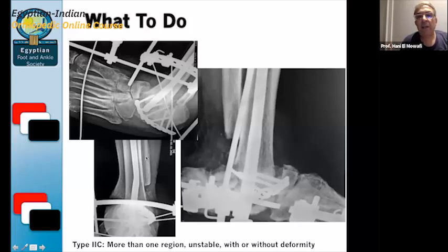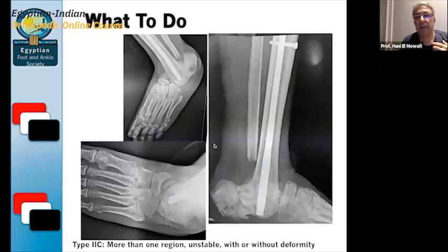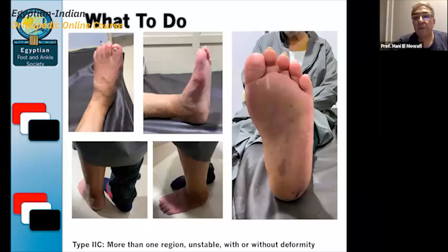After that, we removed the plate, but we removed the apparatus first. While removing the apparatus, there was a dehiscence of the skin, and the plate was compressing the skin, so we removed it. After 6 months of follow-up with Elizarov, the patient can walk and everything is okay. I'm sorry I couldn't present the last follow-up, but he's working very well and is satisfied with his results.